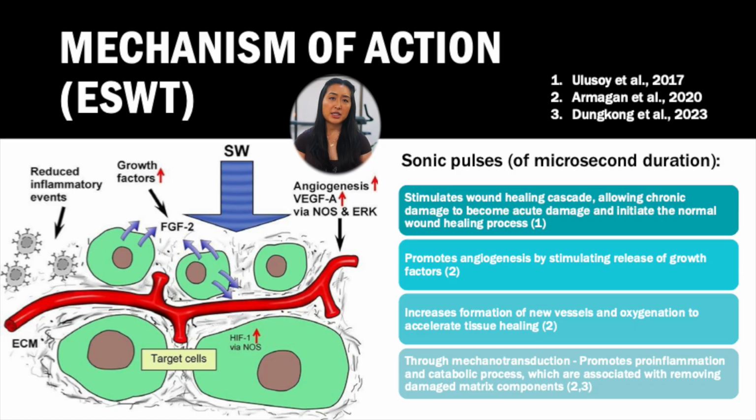After reviewing randomized controlled trials, systematic reviews, and meta-analyses, the literature all seems to agree that shockwave therapy uses sonic pulses to stimulate the wound healing cascade. This stimulation then allows chronic damage to become acute damage in order to initiate the normal wound healing process. Therefore, shockwave therapy is viewed as a pro-inflammatory modality.